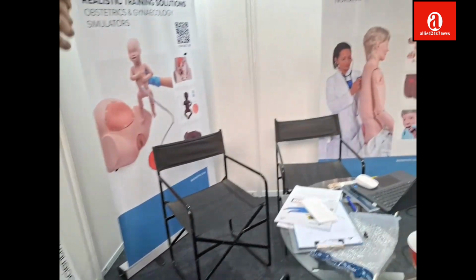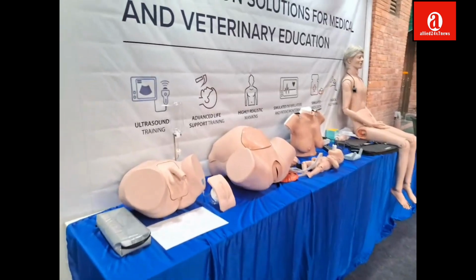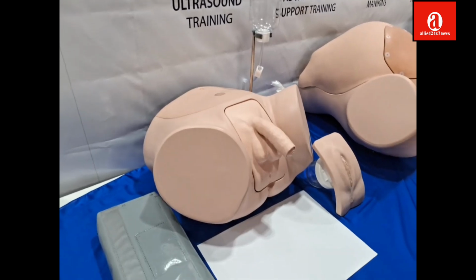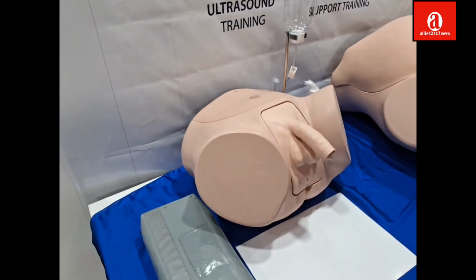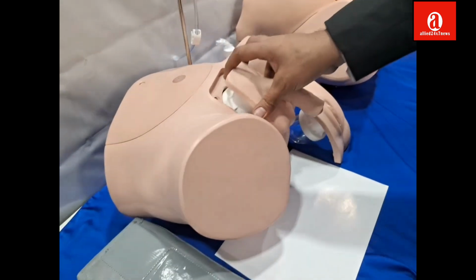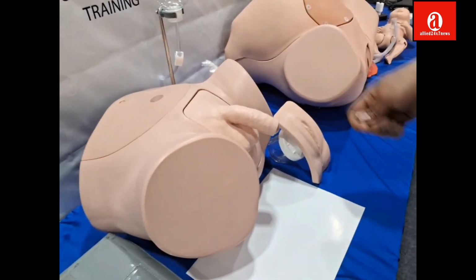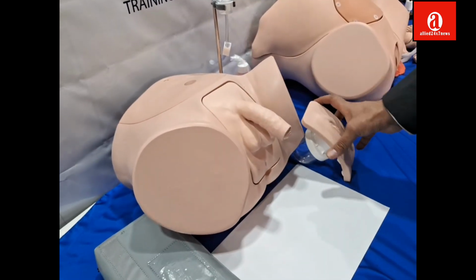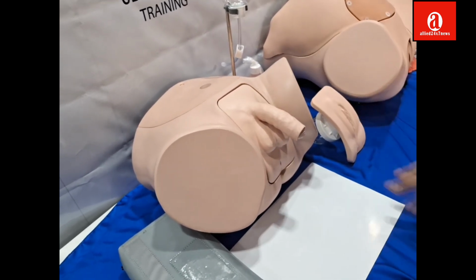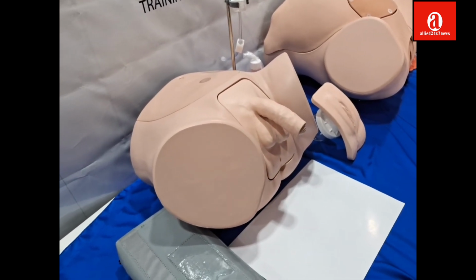We have it here. These are the posters in roll up. This is a catheterization simulator. There's a male and a female catheterization simulator. It is very easy to apply and easy to change and replace. It's also connected with a reservoir here. So the students can actually put the catheter inside, French 12 to 14 catheter size. They can introduce it inside the urethra and simulate drawing urine. They do the standard procedure as per the checklist.